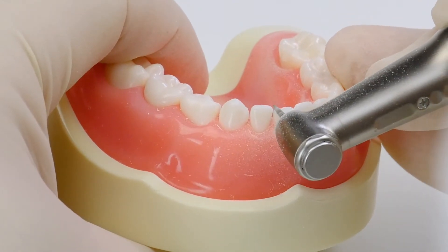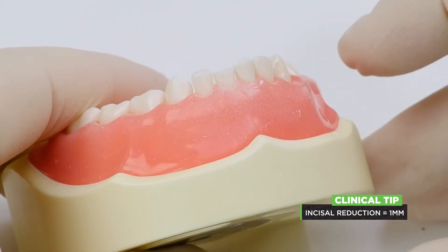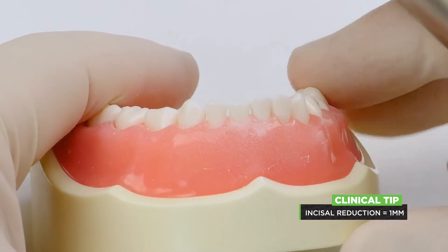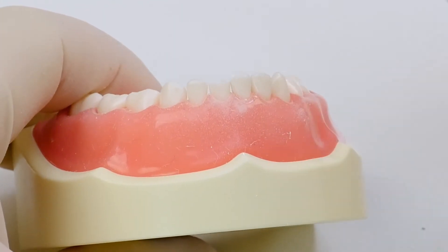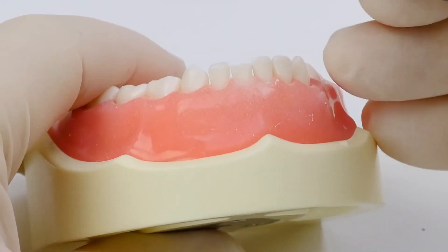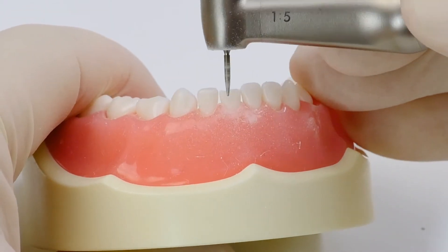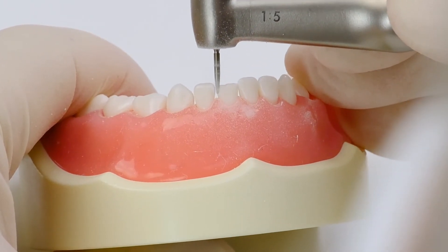It's not very much reduction. Your incisal reduction ends up being about a millimeter or so — a little bit less than what you do with the other teeth. With your upper incisors you go between a millimeter and a millimeter and a half; this one all you need is really about a millimeter.